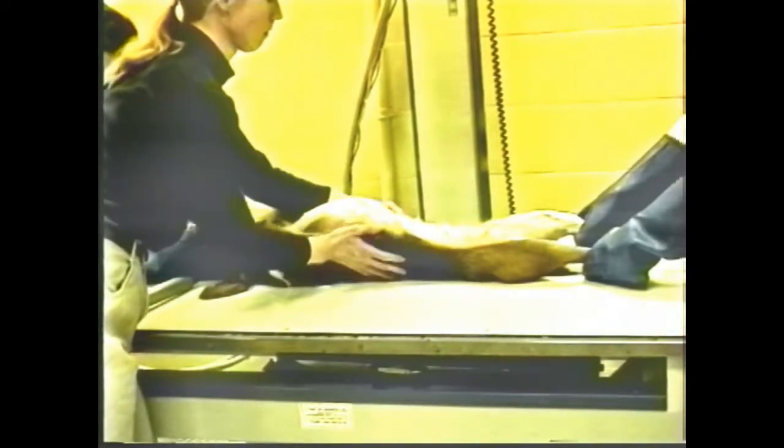If the mid-abdomen is measured and the technique set by that measurement, the film will be underexposed for proper interpretation. The film must be centered over the umbilicus and must extend from the xiphoid to the hip joint.